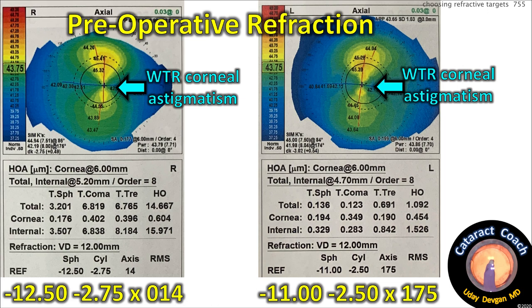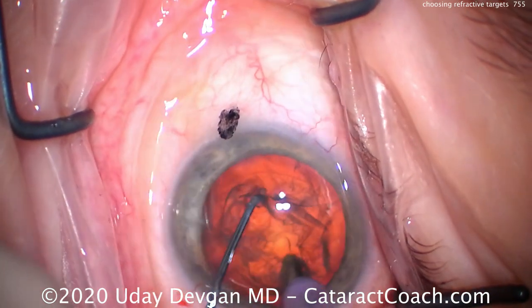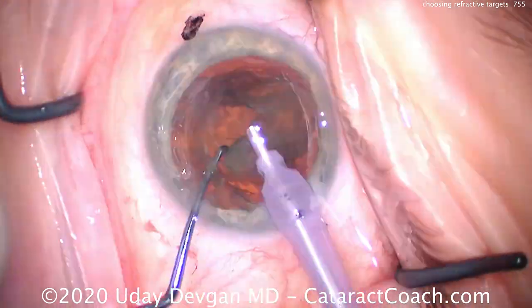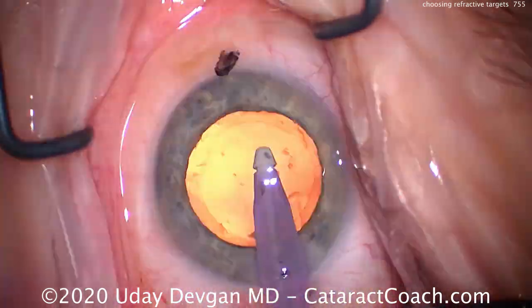Here's the patient: minus 12, minus 11 of myopia, two and a half of astigmatism. Let's do this cataract surgery. My technique is phaco-chop in the capsular bag, splitting the nucleus so we can remove it. The nucleus and cataract removal goes well, no issues at all. Clean up all the cortex.